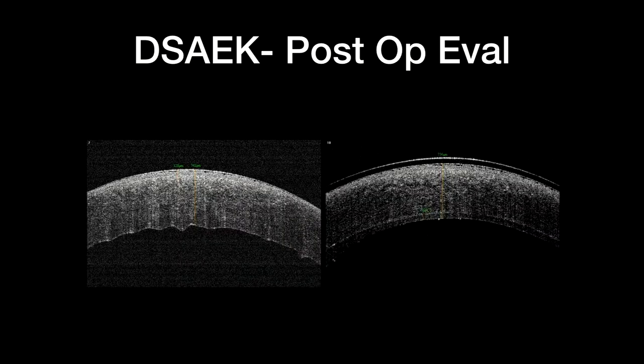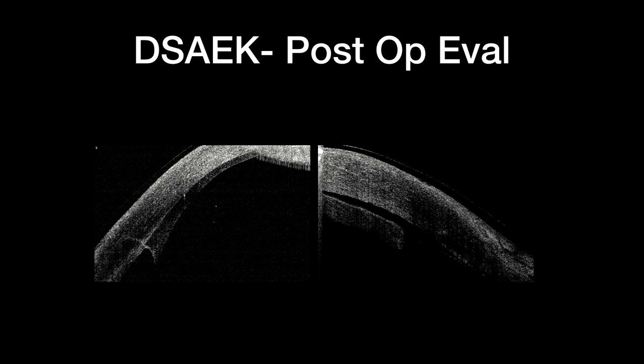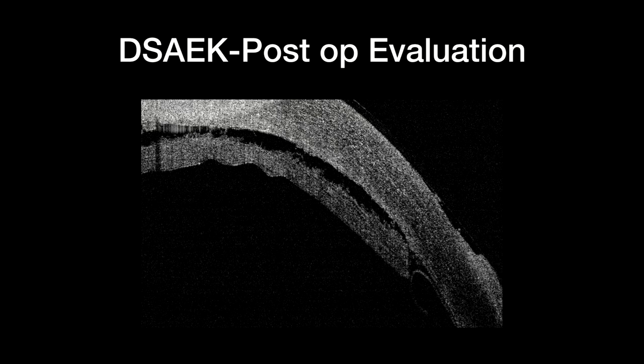And this is the last part. In comparison to the anterior lamellar keratoplasty, where pre-op OCT is important, in endothelial keratoplasty the post-operative OCTs are more important. This is how it typically goes, from top right and then bottom, that the graft usually thins over time, and this is how you monitor. So it's important to scan all areas. In this case of ultrathin DSEK, which has been done, you can see that one area is attached, but the other side of the graft was detached, and it might need an air injection.